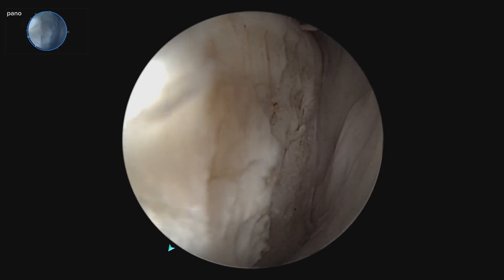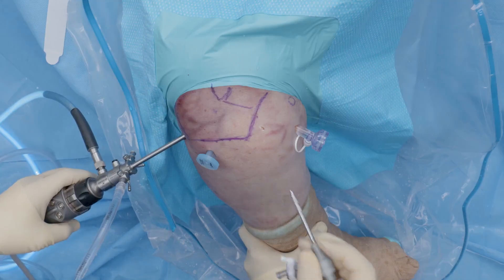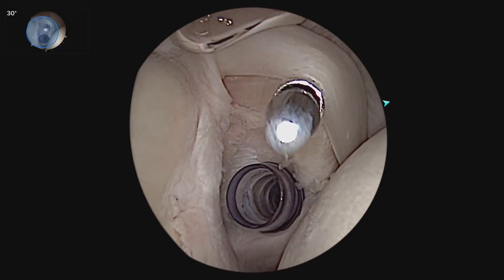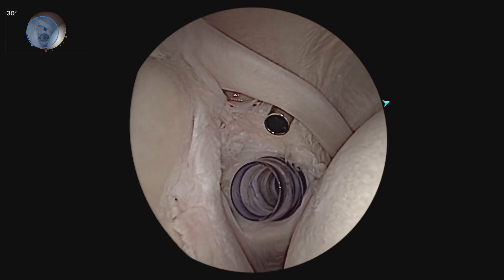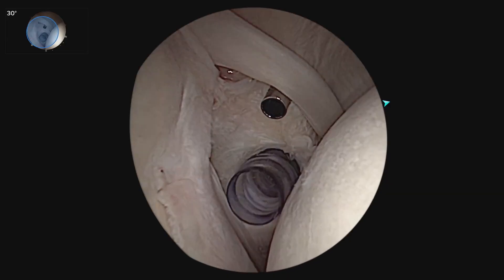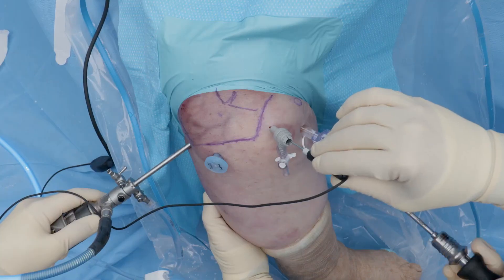This is consistent with an anterior inferior shoulder dislocation. I like to use an ASL portal as a secondary working portal up in this corner right behind the biceps, and I like to insert a short nano working cannula in this area for our nano instruments, which keeps it out of the way from our large working portal just off the superior border of the subscapularis.